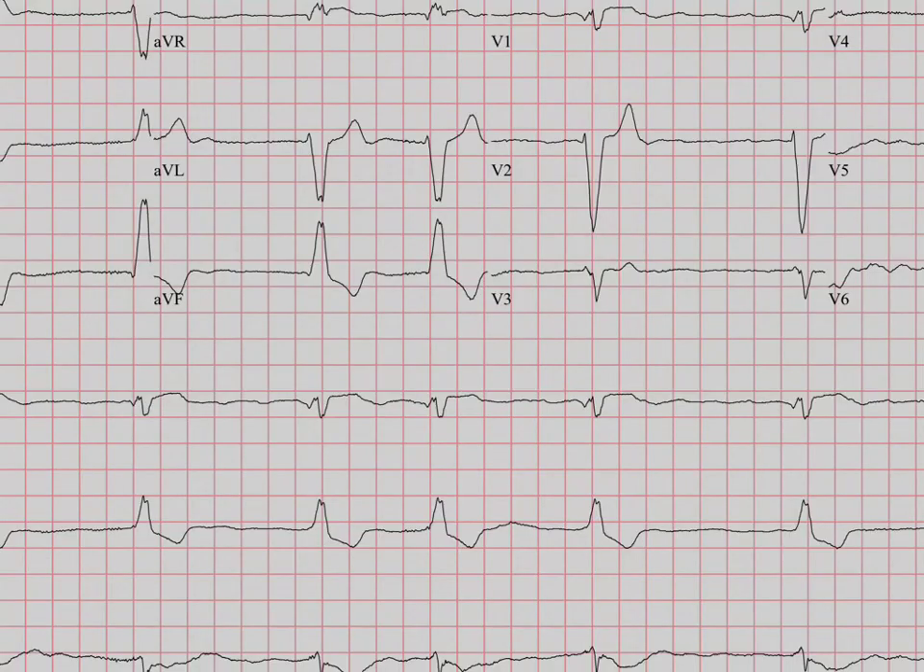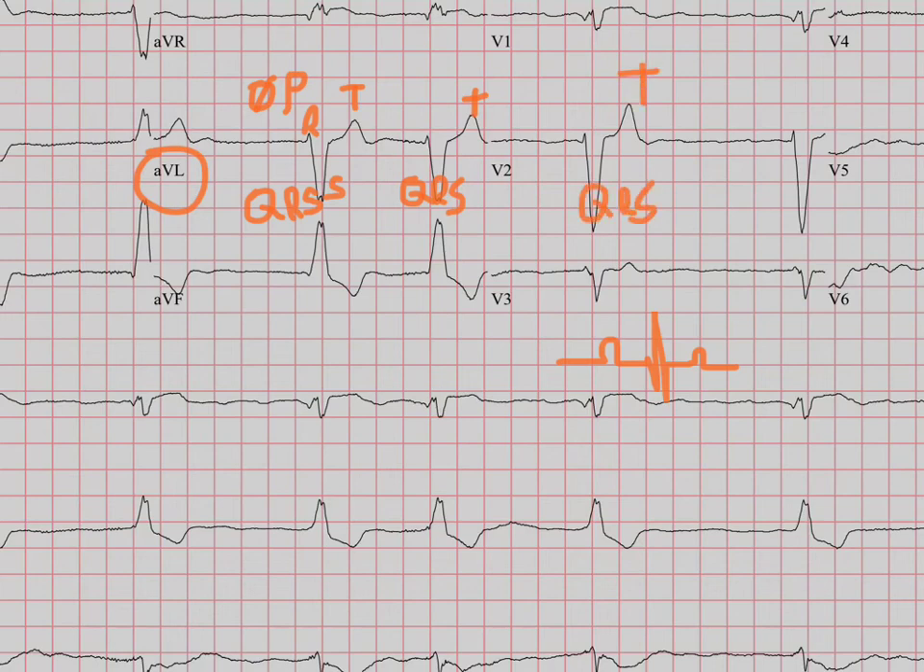Let's look at one more here. This looks complicated, but we're just going to simplify it and look for that P, Q, R, S, T morphology. Let's pick this lead here, aVL. We see it's kind of bumpy here, but I don't really see any P waves there - no P wave. But there's definitely this R and then this S, and even though there's no Q, we'll still call that the QRS complex. And then there's a T. Then again, no P wave, then our QRS and T. Continuing on - no P, but then there's your QRS again and your T. This is not normal sinus rhythm because it's not following our P, Q, R, S, T. This is actually atrial fibrillation.